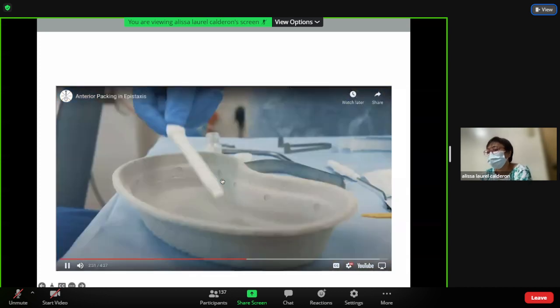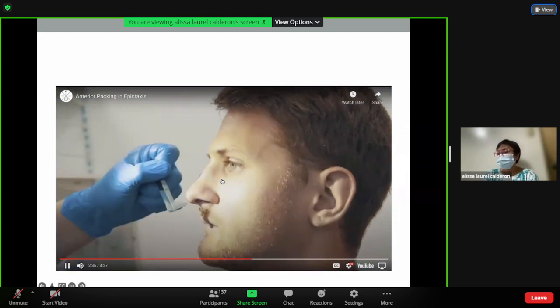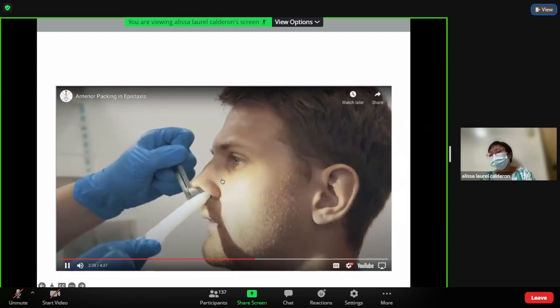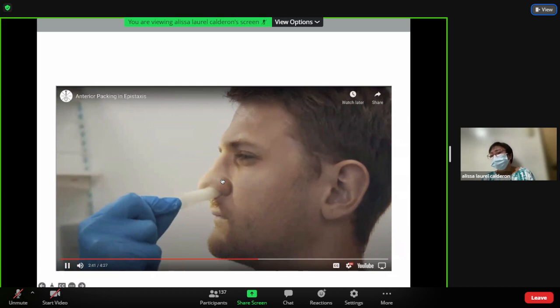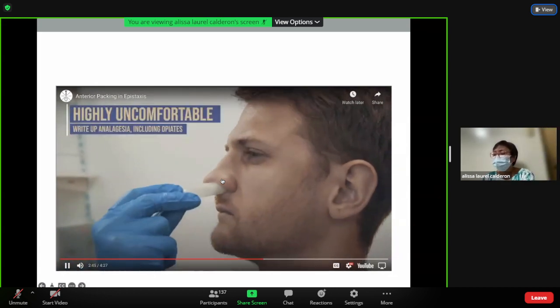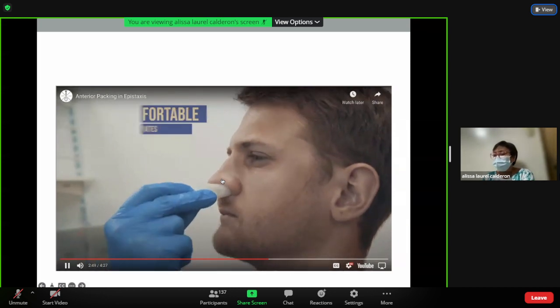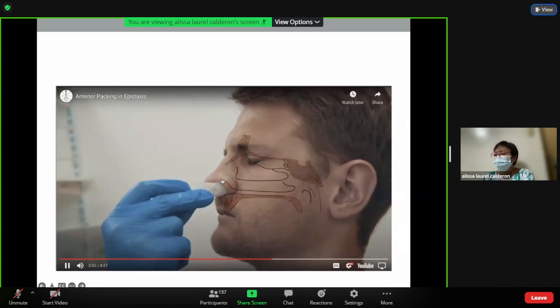Use a nasal speculum to visualize the nasal floor prior to insertion. This allows for compensation for differing anatomy, for example, in a deviated septum. This can be uncomfortable for patients, so please ensure that they are written up for good analgesia, including opiates. Remember that the floor of the nose lies in a horizontal plane. It is natural for the patient to tilt his head upwards. Discourage this as it makes your orientation harder.